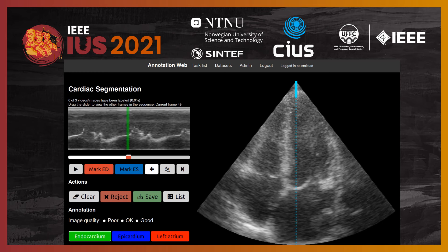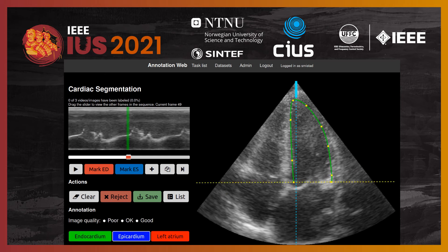Here is the left ventricle segmentation tool, in which you can select end-diastole and end-systole frames, with an M-mode display on the top left. The endo and epicardium, as well as the left atrium, can be annotated using splines and control points.